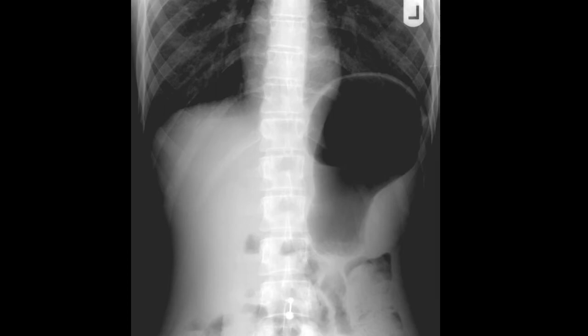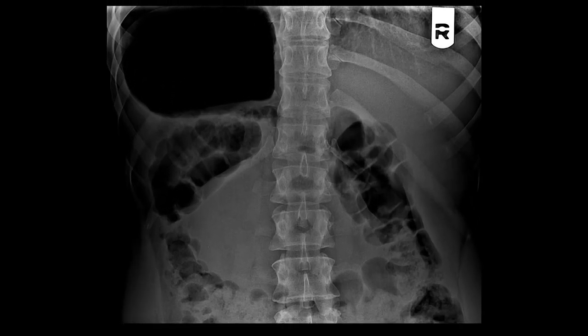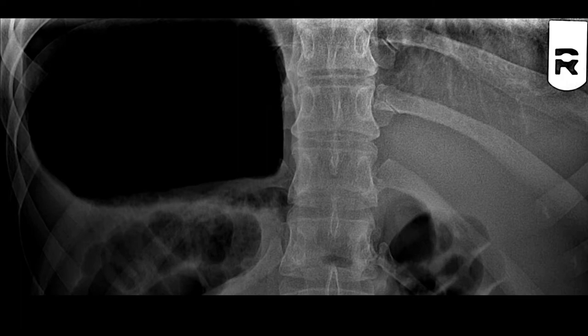When obstructions occur, those usually occur in the lower or small intestines. On this case it's tough to miss that big black spot in the left upper abdomen, and while this gastric air bubble is very prominent, it does not represent pathology. A mass or a tumor will show up as an area of increased density, not an area of lucency like we're seeing here.